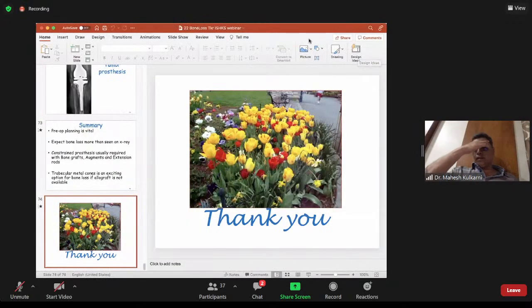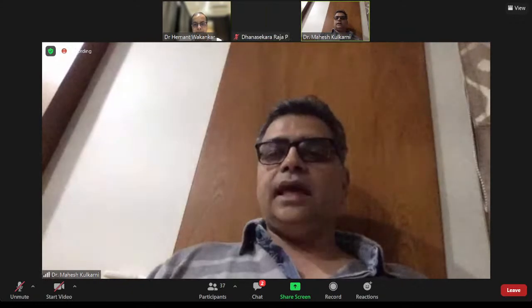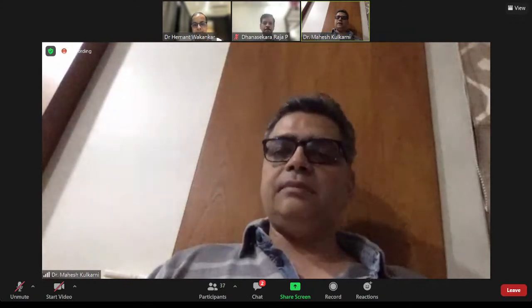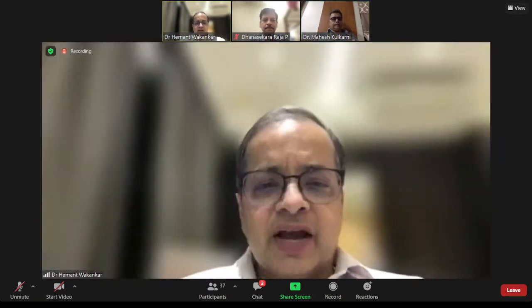Thank you very much, Hemant. There are a few questions which have already come up in the chat box. The question is, in your revision unicompartmental case, can we use a sleeve and a stem instead of filling the defect medially? See, sleeves can certainly be used.